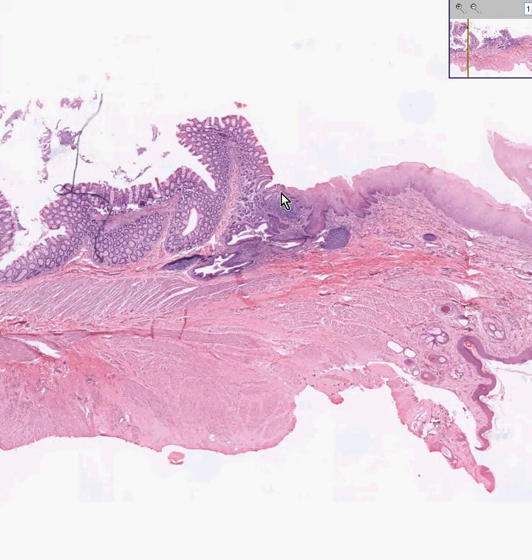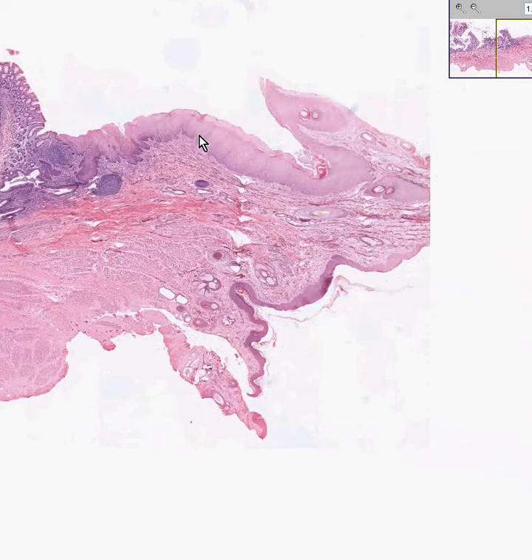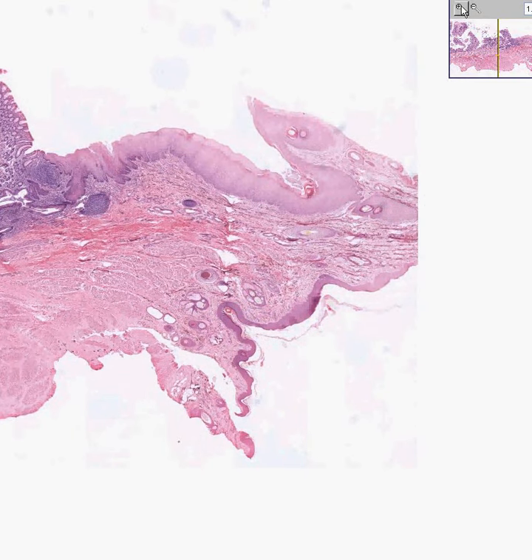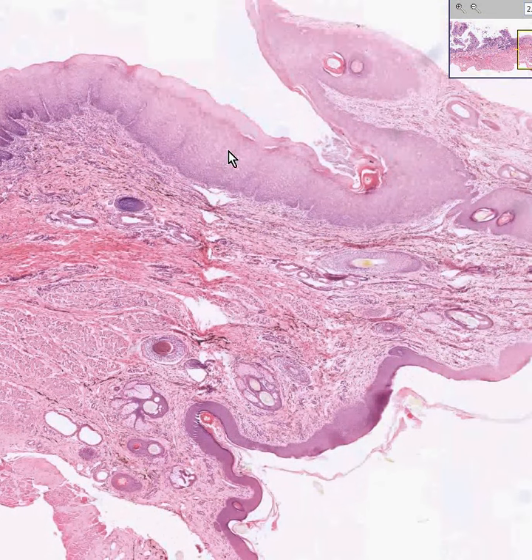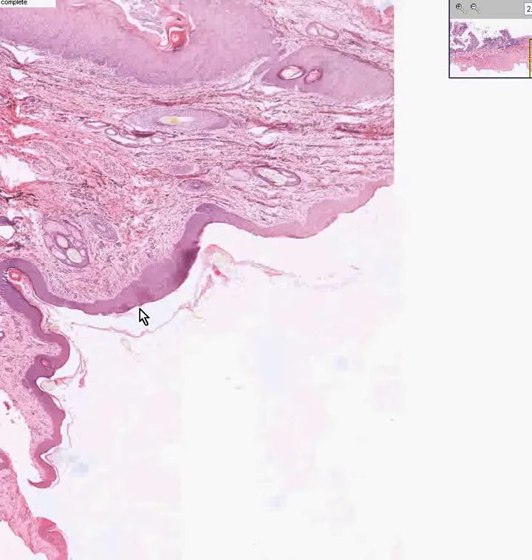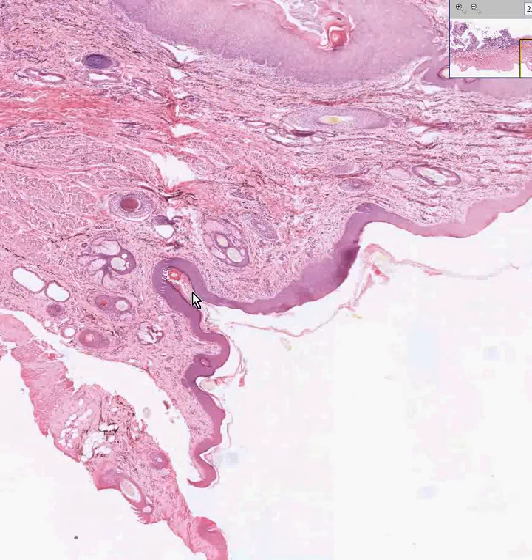The epithelium is only one cell thick. Also notice that it is not very long after you get the squamocolumnar junction, then you get much more than just stratified squamous mucosa. You get keratinized stratified squamous mucosa with skin appendages, which is the definition of skin.